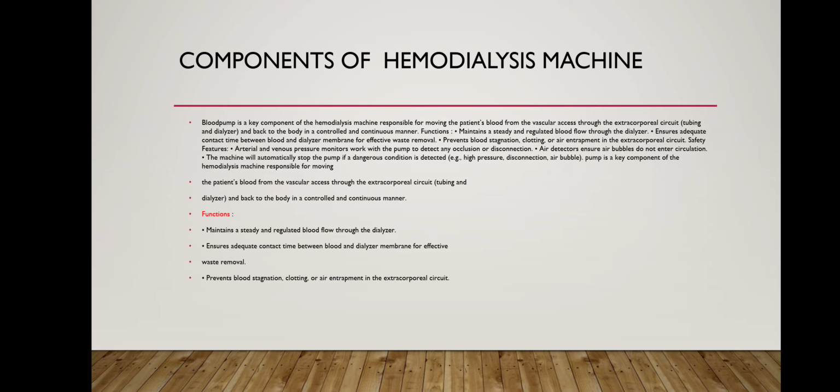The pump is a key component of the hemodialysis machine, responsible for moving the patient's blood from the vascular access through the extracorporeal tubing and dialyzer and back to the body in a controlled and continuous manner. The main functions are to maintain a steady, regulated blood flow through the dialyzer, ensure adequate contact time between the blood and dialyzer membrane for effective waste removal, and prevent blood stagnation, clotting and air entrapment in the extracorporeal circuit.